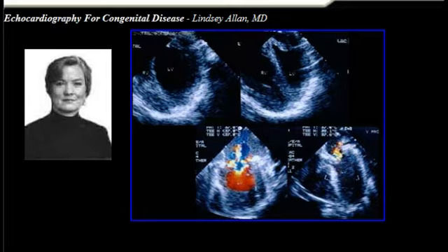And here was a patient, again, this is not very common, but it happens from time to time, after repair of an atrioventricular septal defect. Despite the fact the mitral valve, or the left-sided component of the AV valve, had been tackled surgically, as we came off bypass we realized there was quite a lot of regurgitation from this AV valve, and the surgeon had to go back on bypass in order to re-repair the left-sided component of the common valve.